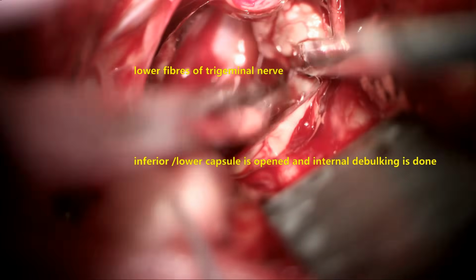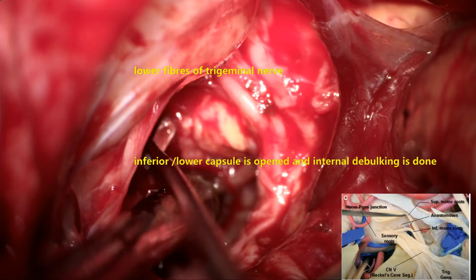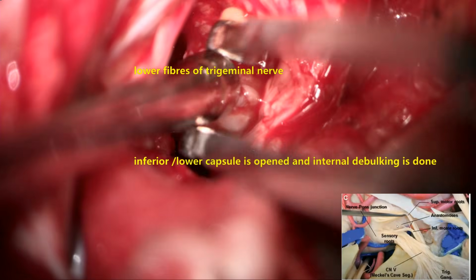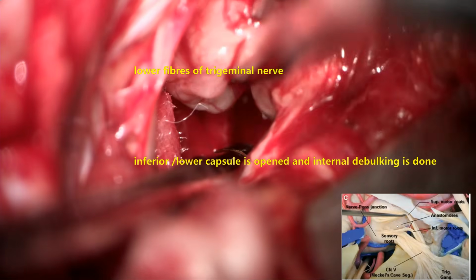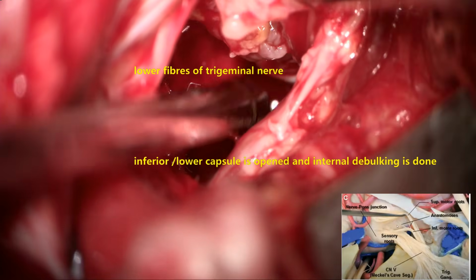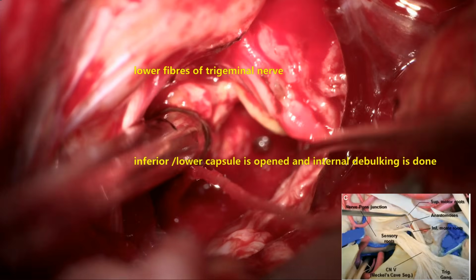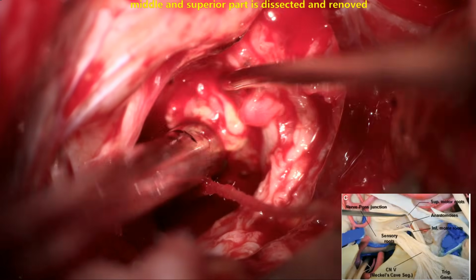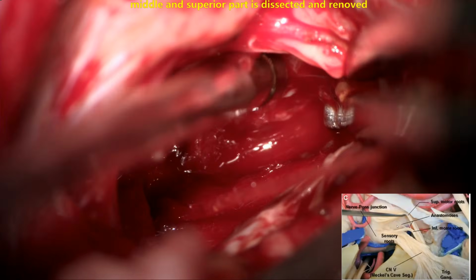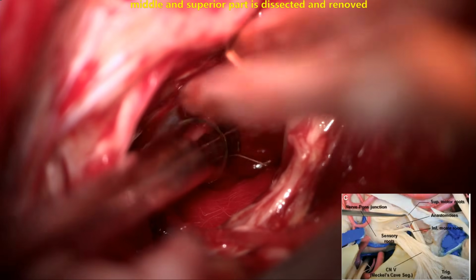Now you can see once we do that, the anterior part of the tumor is easily and gently separated from the posterior part of the petrous bone, and that part of the tumor is held and removed piecemeal from the main part of the tumor, which is adherent to the lower nerves or lower rootlets of the trigeminal nerve, predominantly sensory, coming from the medulla oblongata and upper cervical spinal cord.